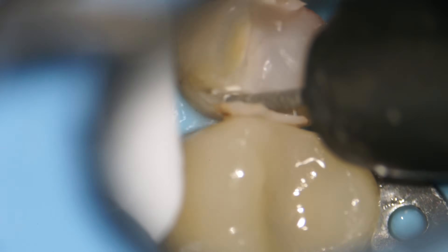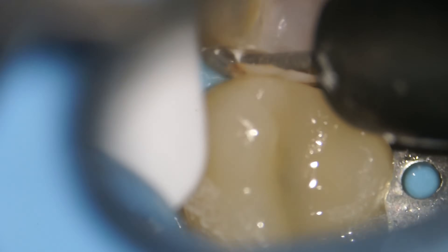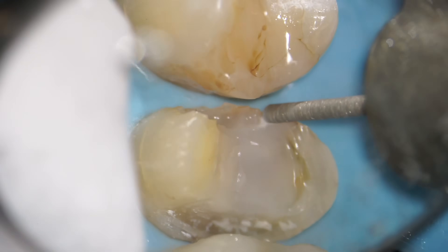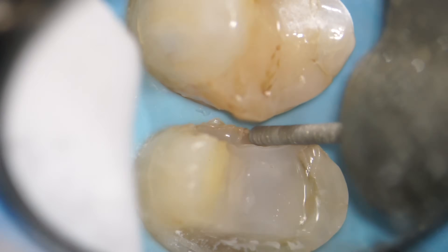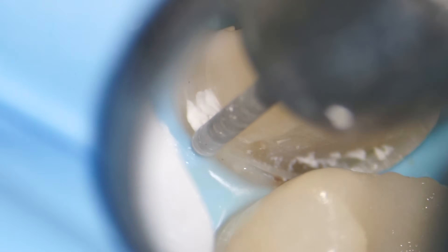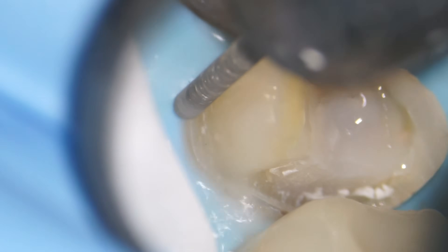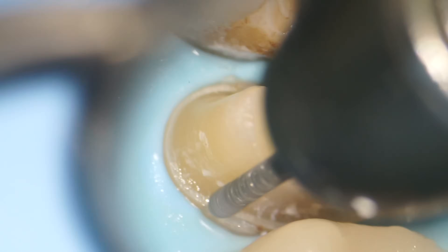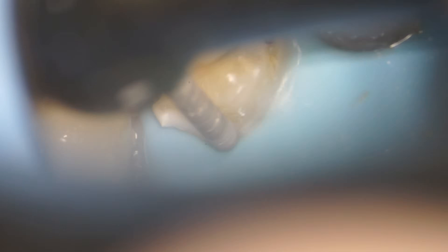We also need to trim around the perimeter of the tooth, all the way around. We don't need to take two millimeters off here, but we do need to take about anywhere between 0.6 millimeters and 1 millimeter. We spend our time being very conservative, trying to take as little tooth structure away as possible, but also making sure that we have enough reduction such that the porcelain crown isn't going to break. It's also vital that everything is perfectly smooth so that the lab can make a perfectly fitting crown.